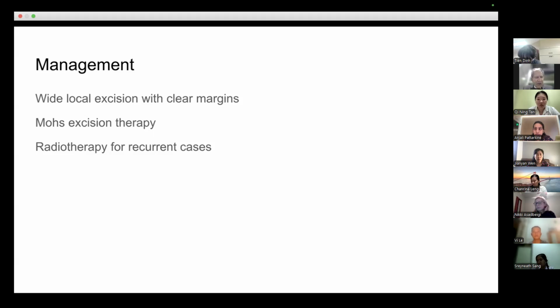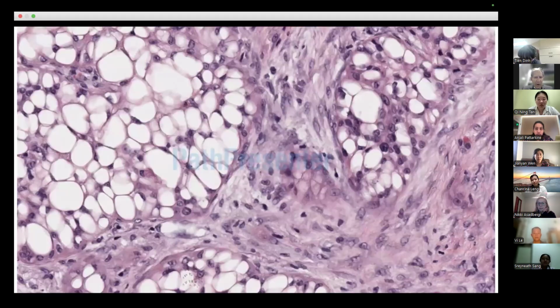So, Nikki, we see clear cell changes in squamous cells in other organs as well, usually not quite as pronounced and pleomorphic as this one, but it is a feature where you have sharp cytoplasmic borders and fairly clear cytoplasm that you can see in cervical cancers and squamous differentiation in endometrial tumors or lung tumors that have squamous origin. So it's good to be aware of this propensity of squamous cells to occasionally present as apparently clear cells, and in this case with the nuclei pushed to the side, resembling renal tumors.